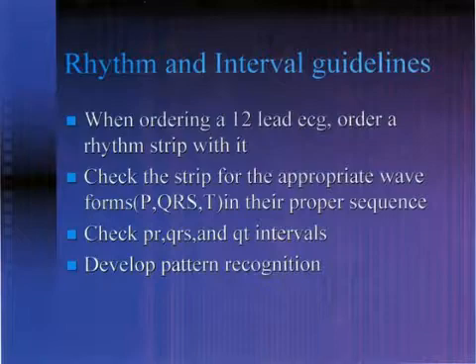Finally, the last point is pattern recognition. This is something that comes with experience, and I suspect as the students review more tracings, they will begin to start recognizing certain rhythms. Very true, Melissa. An example is atrial fibrillation. This is the most common sustained outpatient arrhythmia seen in our primary care clinics, and after seeing it several times, I think the students will begin to recognize that pattern almost immediately.